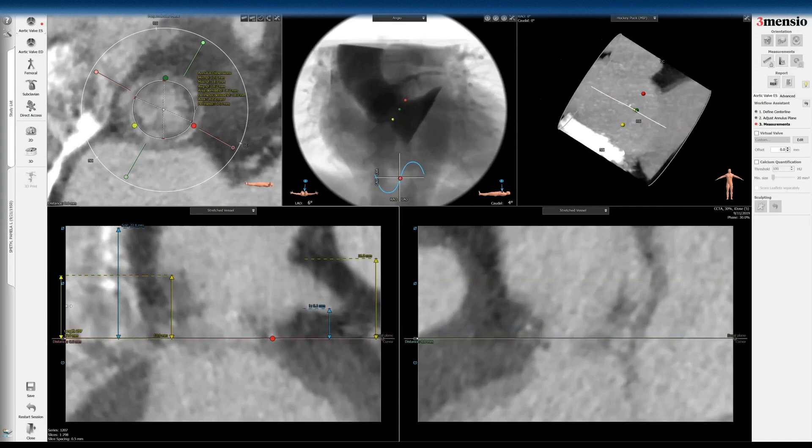What I'm doing here is drawing a box. The box represents the leaflet being pinned open like a cylinder effect once the surgical valve is replaced with the transcatheter valve inside. Here I'm drawing a waist of 20mm, because you're going to use a 20mm balloon-expandable valve — or even with a 23mm self-expanding valve, the waist is going to be 20mm. You could also put 17 or 18mm here, since that's really what the valve will be expanded to. Remember, this is a porcine valve, so the top of the stent posts will actually be higher than the porcine leaflets themselves. So the risk plane is actually less, and also because the valve is mounted internally with the leaflets, you're not going to expand beyond the stent ID. So a 20mm waist is a more aggressive estimate.